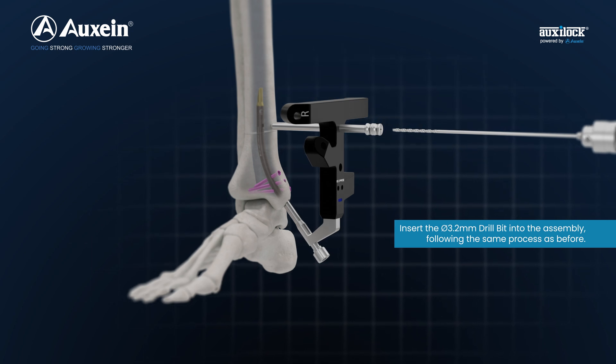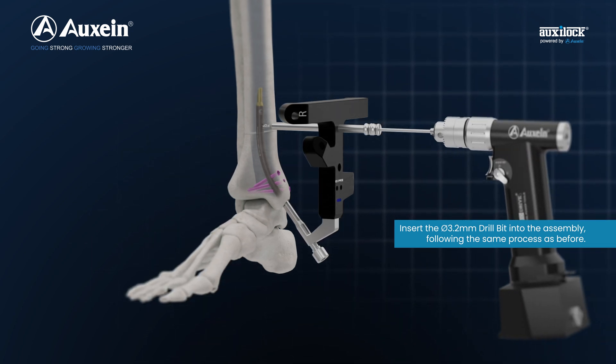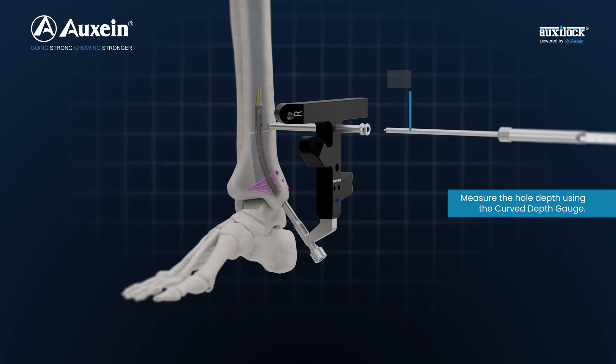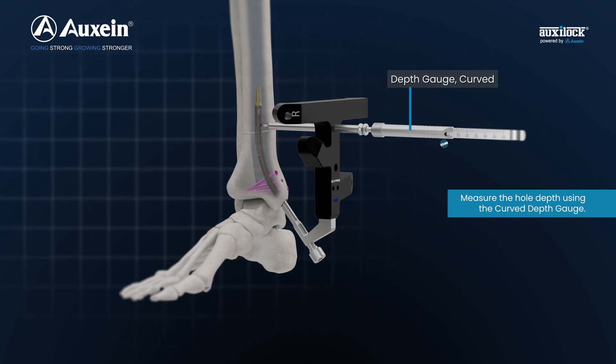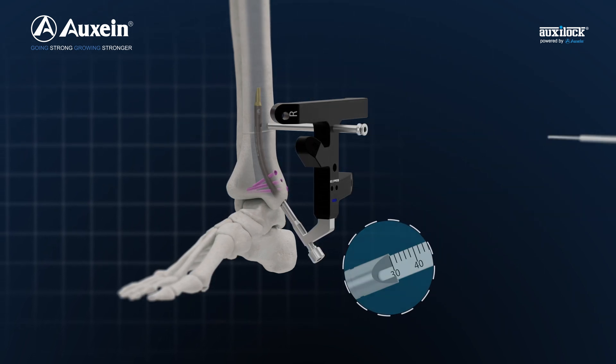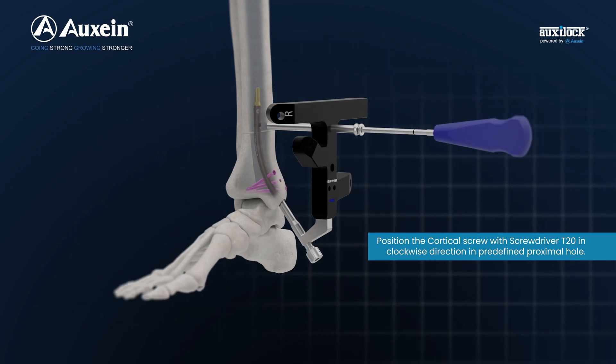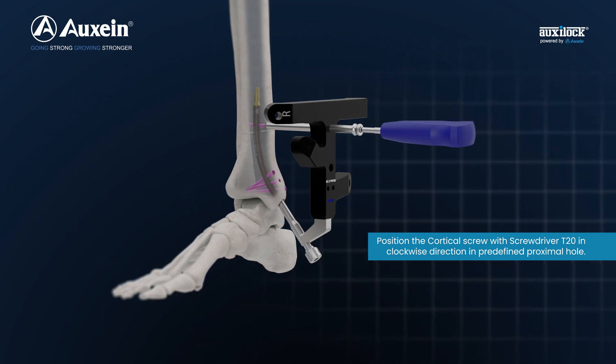Insert the 3.2 mm drill bit into the assembly, following the same process as before. Measure the hole depth using the curved depth gauge. Position the cortical screw with screwdriver T20 in clockwise direction in the predefined proximal hole.